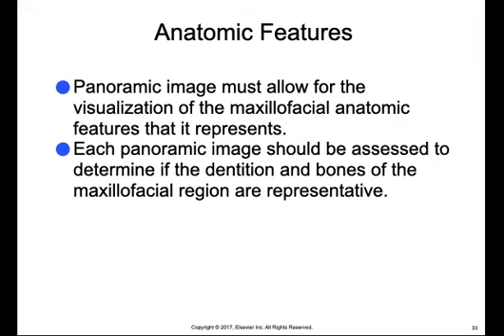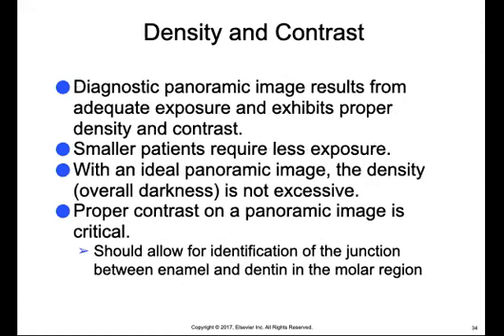Each panoramic X-ray should be assessed to determine if the dentition and bones of the maxillofacial region are representative. The diagnostic panoramic image results from adequate exposure and exhibits proper density and contrast.